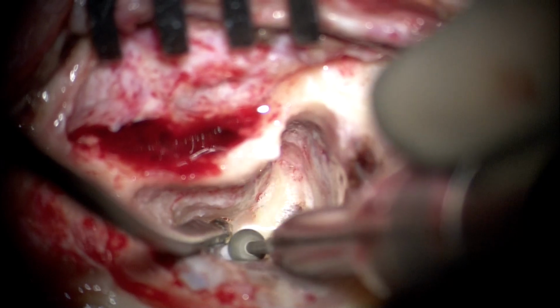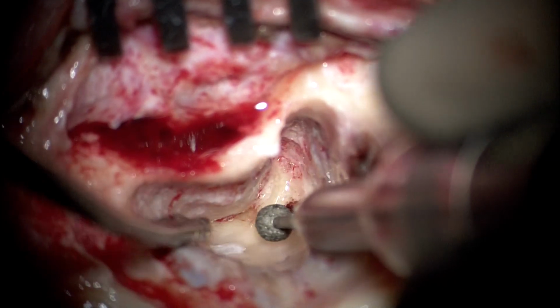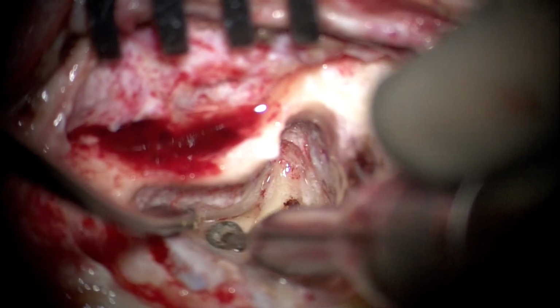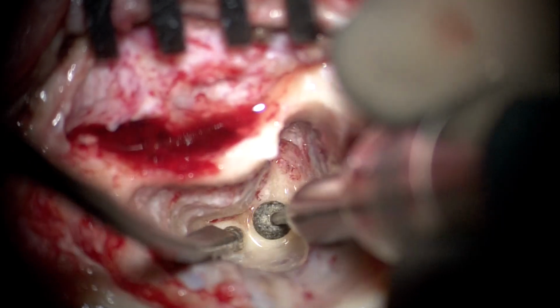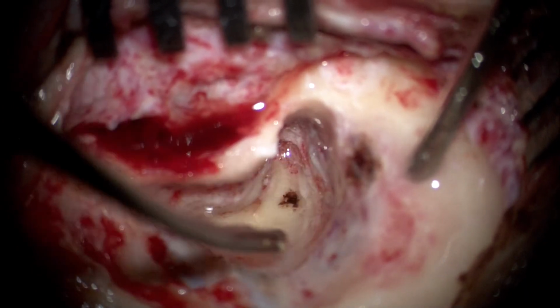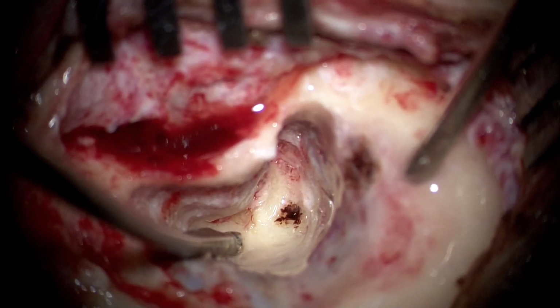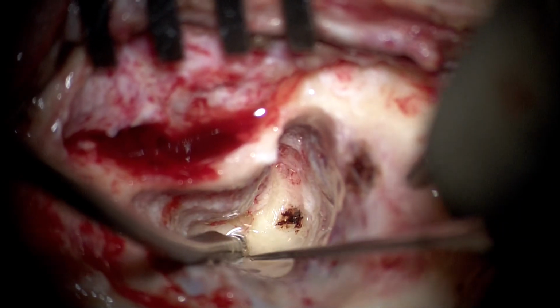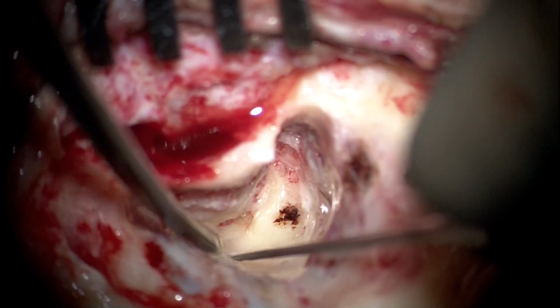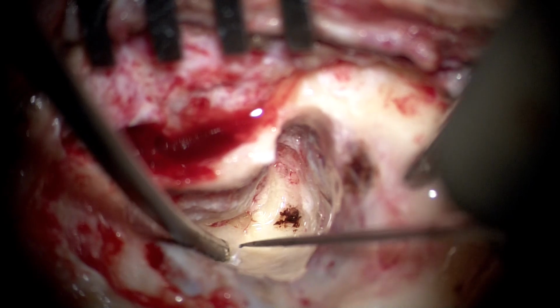The endolymphatic sac too has been opened with the drill. We can just see the double shadow of it. This is the endolymphatic sac that has been drilled open, which is also another standalone procedure for Meniere's, that is sac decompression. This is the endolymphatic sac that has been opened, the whitish shadow of a double dural layer that you can see.